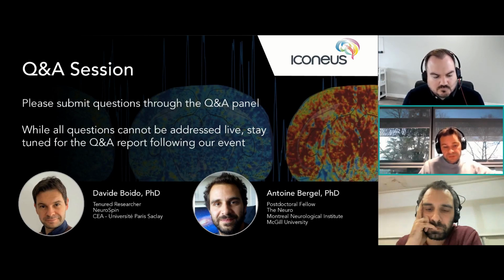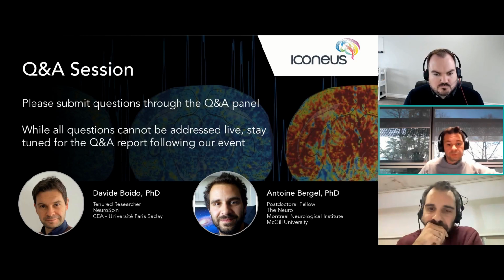And through the skull instead, I think you have to refer to the papers by Sophie Pézet, who did very nice imaging through the skull. If I correctly remember, it's completely feasible in mice. In rats, it's okay for the neocortex. It starts to be a little bit less performant with respect to a craniotomy in the thalamus. So if you are willing to go deep, and then it's another question about the reliability over time.